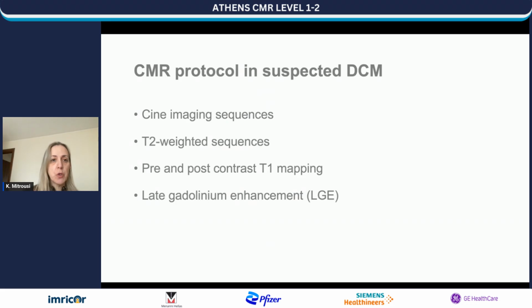Which CMR protocol is used in suspected dilated cardiomyopathy? We always start with the basic cine imaging sequences, followed by T2 weighted sequences, pre- and post-contrast T1 mapping, and of course late gadolinium enhancement sequences.